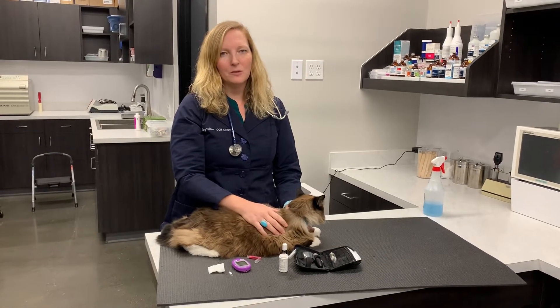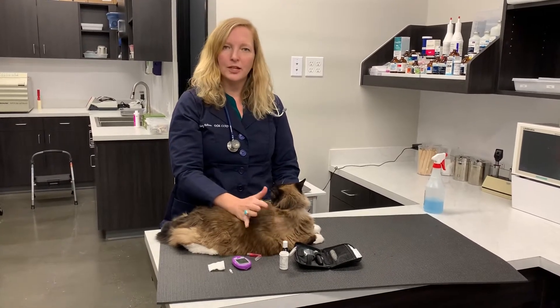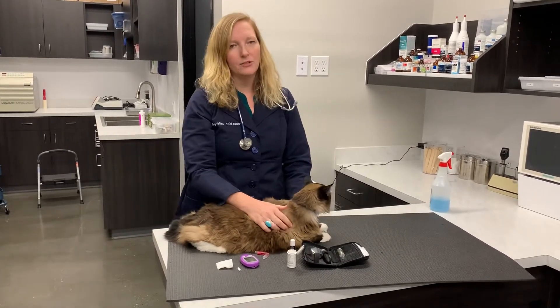Hi, Dr. Felton with Grateful Heart Vet Hospital here to show you how to check your cat's blood glucose at home with the AlphaTrac II system.